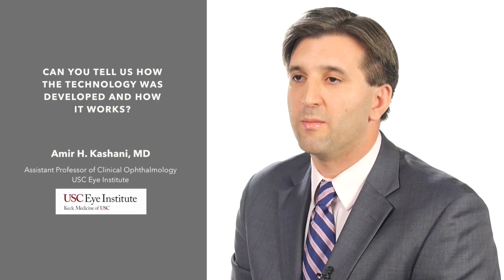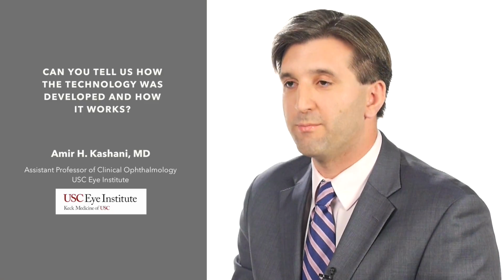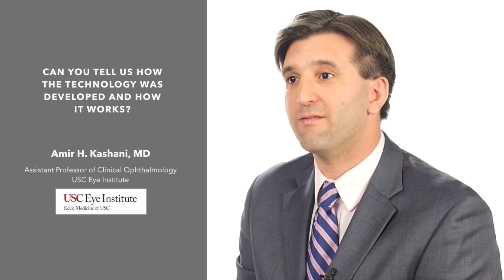in the retina. But it turns out that if we actually look at other things, the other variations in the backscatter light, such as phase, it actually improves the signal quite a bit. So it becomes a signal to noise issue. The more signal you have, the finer the capillaries you can see. So with the current technology, we're using both intensity and phase variations from the backscattered light to detect the red blood cell movement and therefore to create a map of the retinal vasculature.